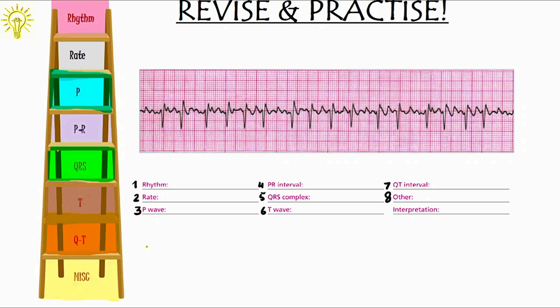Let's just go quickly through this ECG. Now, you can see the rhythm is quite irregular. There is almost 1.5 large box between these two R waves. Let's randomly pick another. This is almost 1. There is almost 2 to 2.5 large boxes. So, I declare it as irregularly irregular. What about the rate? So, we said that for irregular rhythms, it's better to have a 6 second strip. So, let's go for 1, 2, 3, 4, 5, 6, 7, 8, 9, 10, 11, 12, 13, 14, 15, 16, 17, 18, 19, 20, and 21, 22, 23, 24, 25, 26, 27, 28, 29, 30.